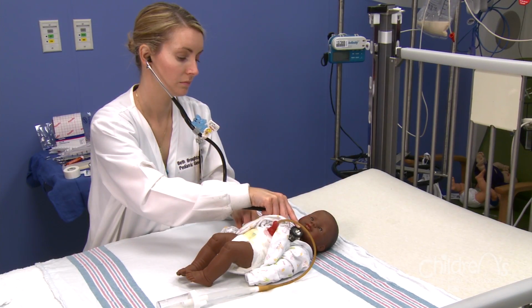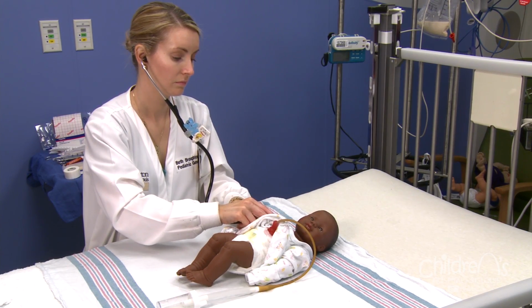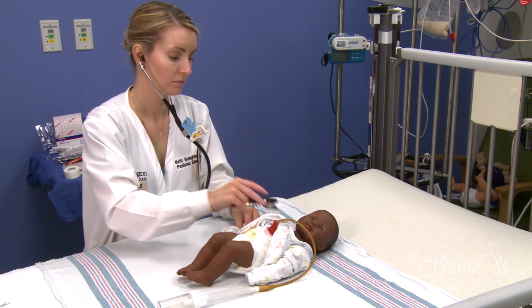Your child will be allowed to have some medications through the tube or by mouth in those first 24 hours. After surgery, the surgical area may be tender for several days. It can also be normal to see drainage around the tube. The nurse will check your child frequently for pain and discomfort after surgery and will give pain medications as ordered by the surgeon.